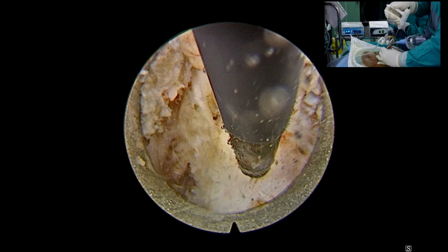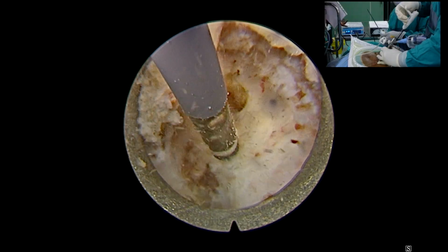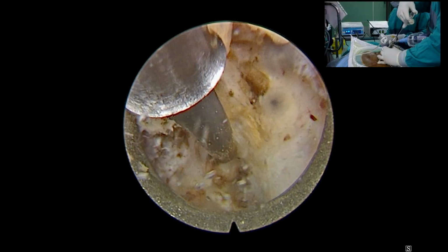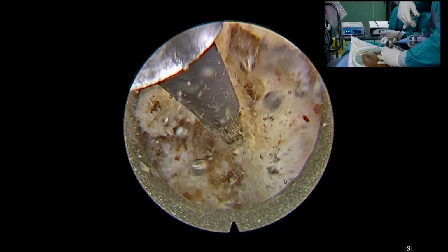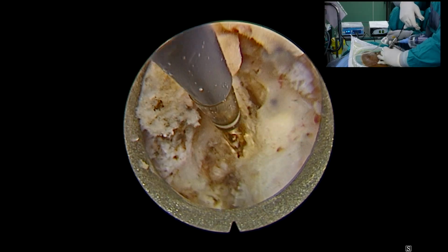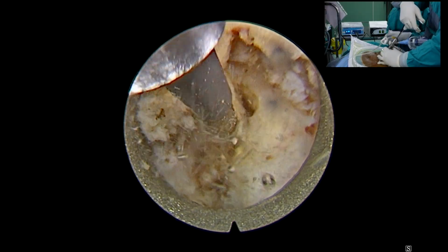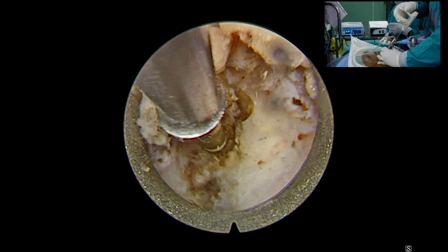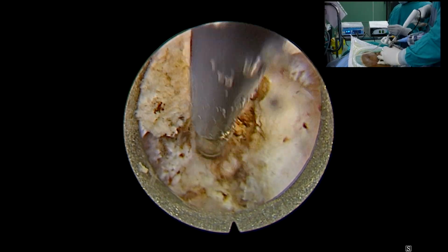This one? No, that's not the flavum yet. This is the flavum. That's the bone, that's the tissue over the bone. That's the upper lamina. Yeah, this part is the flavum.